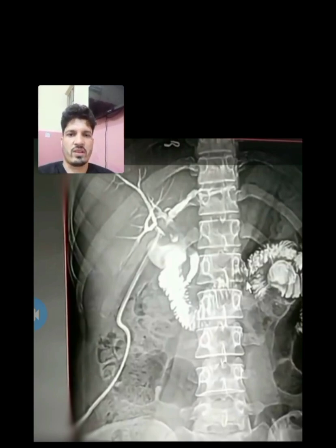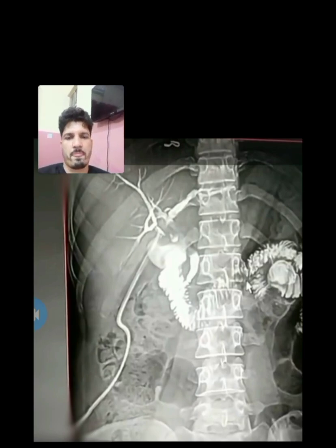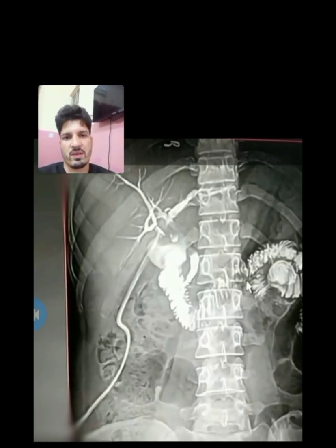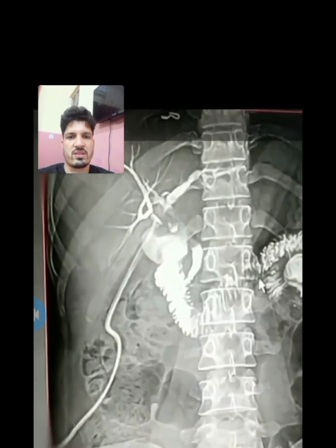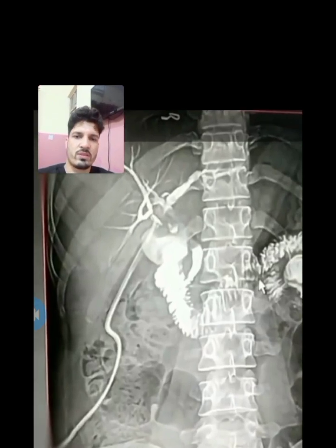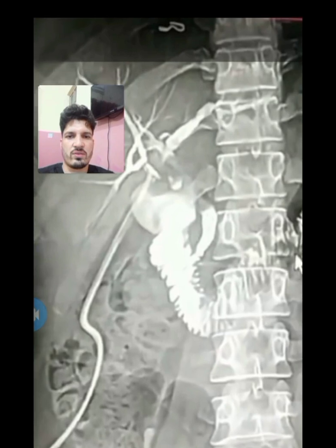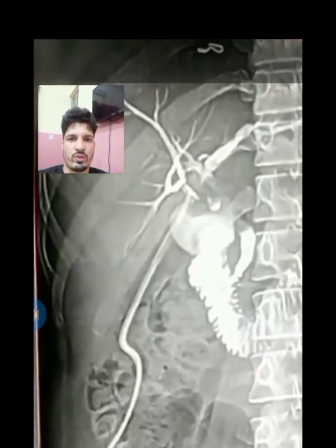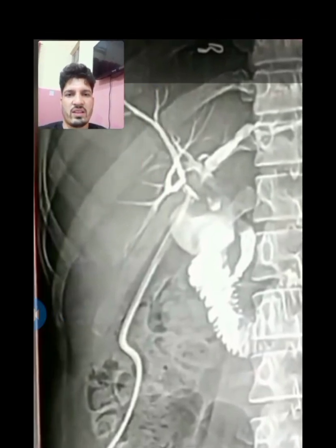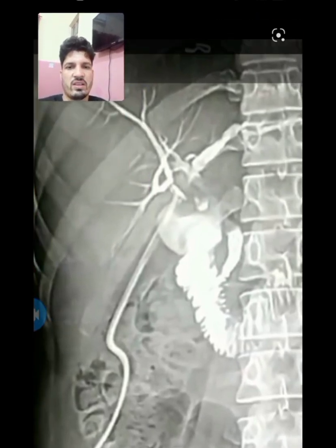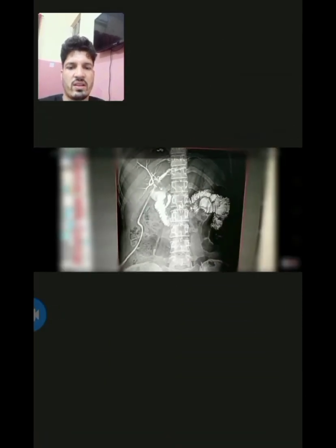Now the second image — this is the T-tube cholangiogram. We have taken this picture after giving contrast to the patient. You are clearly seeing that the intrahepatic biliary system is there, the extrahepatic biliary system is there, and the T-tube is in place. I am now editing this picture so you can clearly identify all the structures.